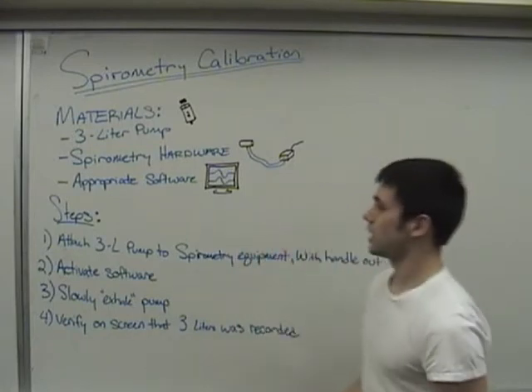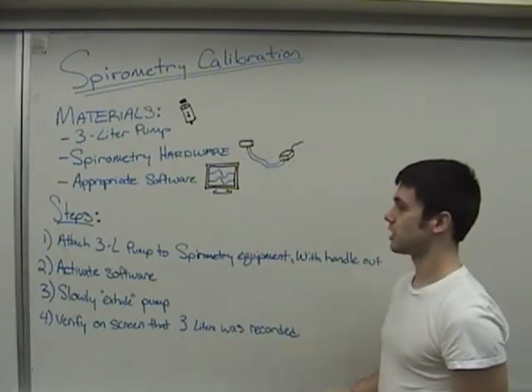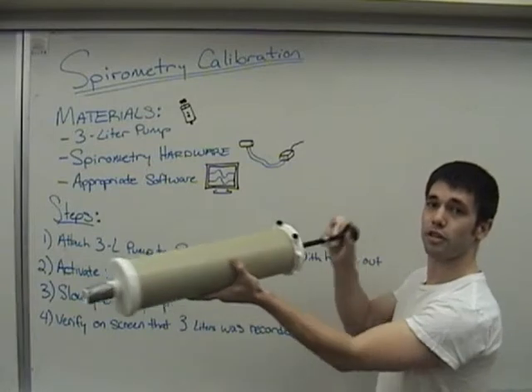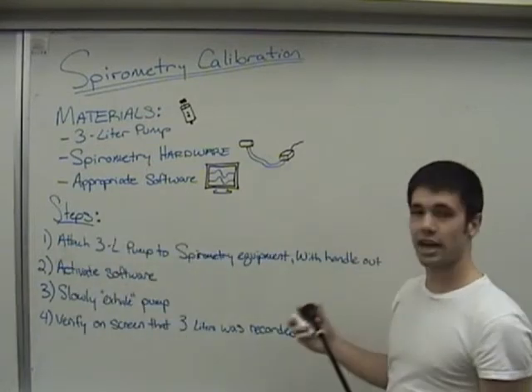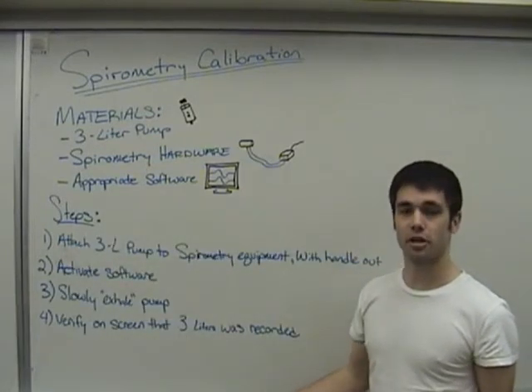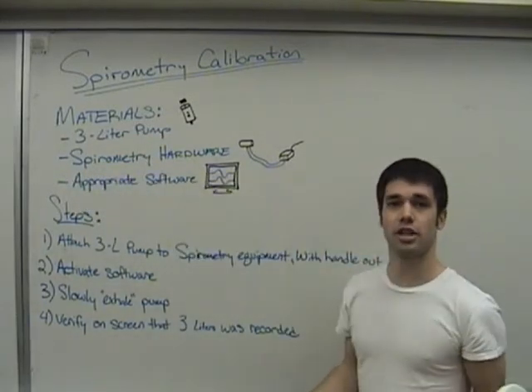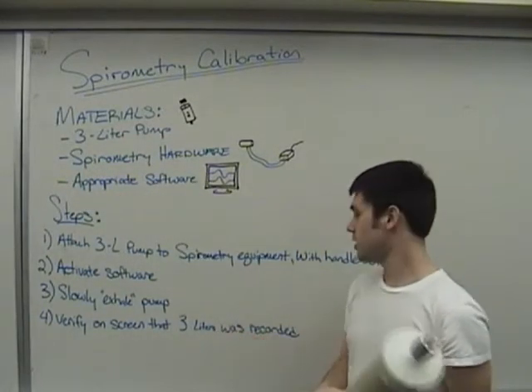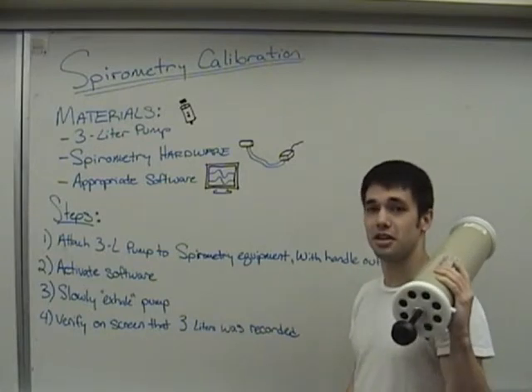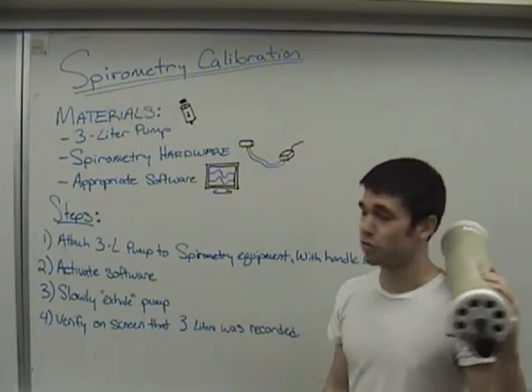The steps that we'll take in calibrating our spirometry is we'll attach the three-liter pump to the spirometry equipment with the handle out. Next, we'll activate the software and ensure that it is running properly. And we'll slowly exhale the pump and verify that the screen is showing three liters. If this is the case, then your spirometry equipment is calibrated correctly.